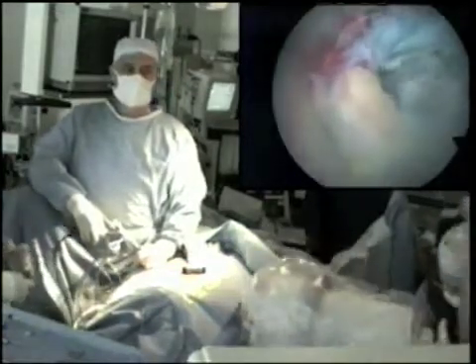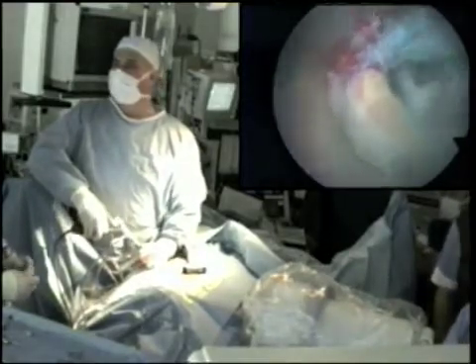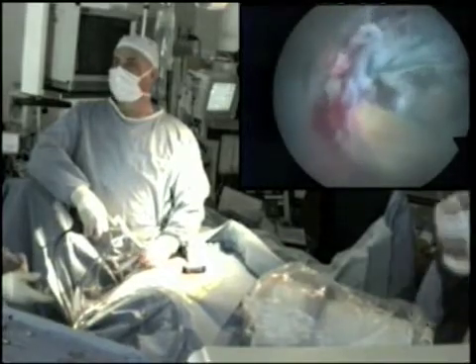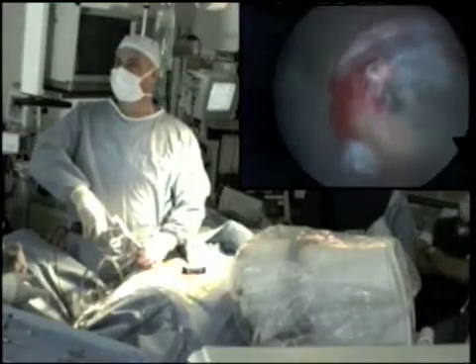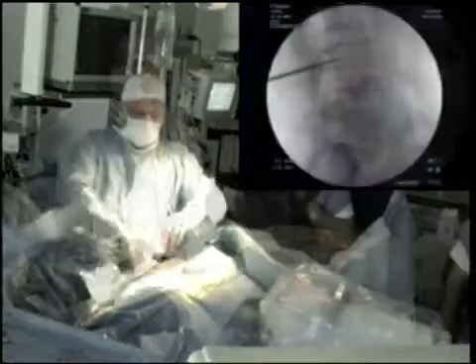The endoscope is inserted through the sheath and is used for visualisation as the sheath is withdrawn from the intervertebral space. This allows any bleeding points to be identified and treated.